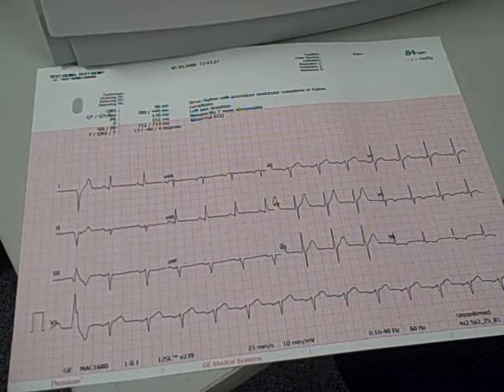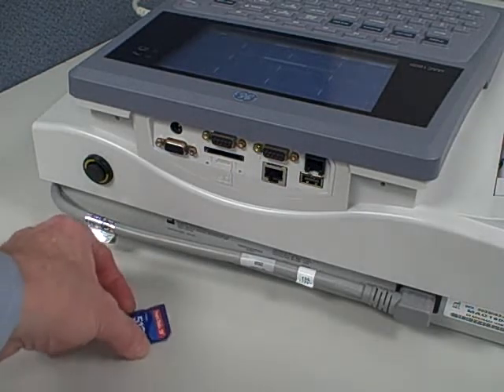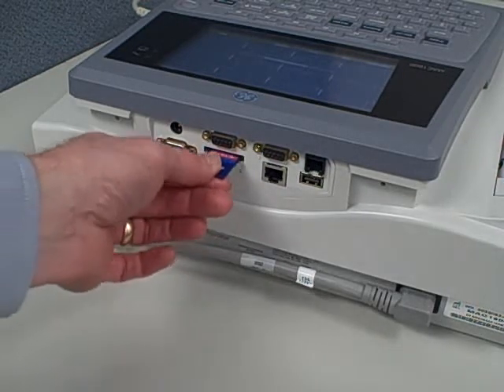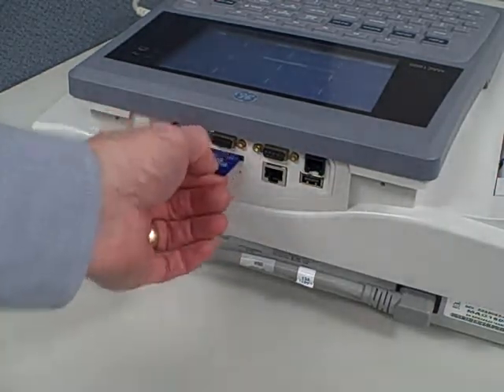Here's a look at the printed EKG. Here's a look at the back of the machine. A rechargeable battery is standard. A few communication options are available, plus flash card storage, which is also unusual in most machines, and will store up to 100 patients.